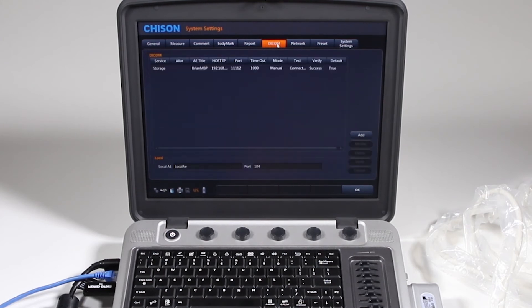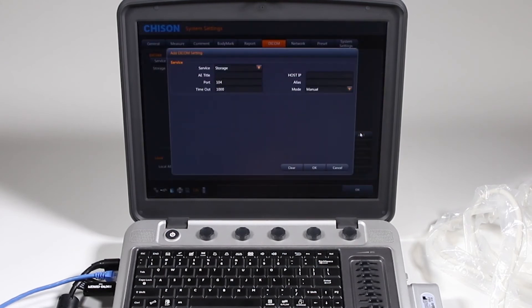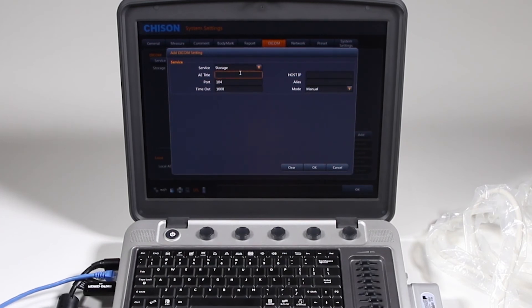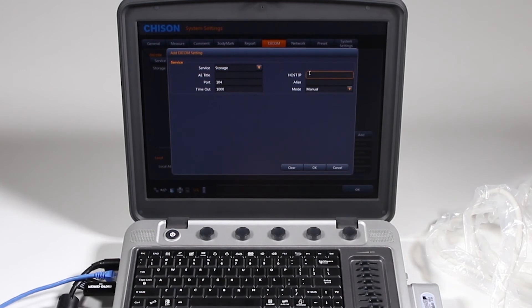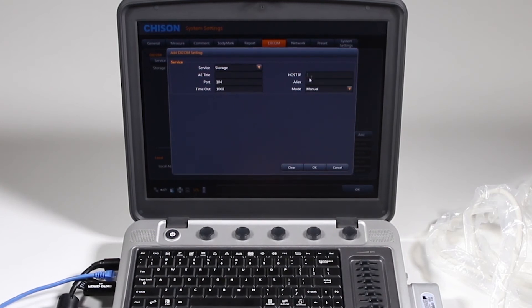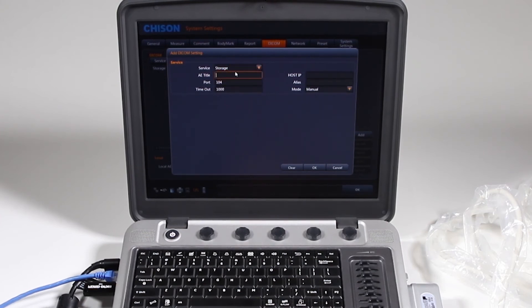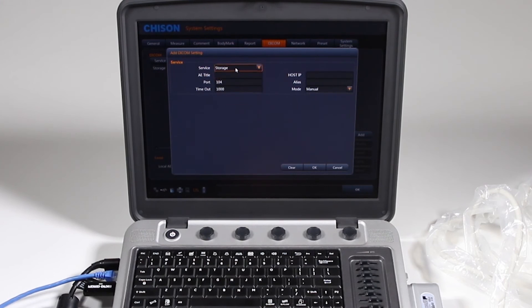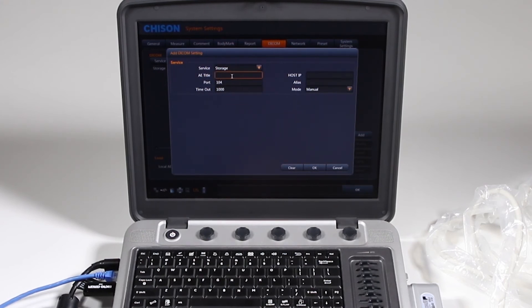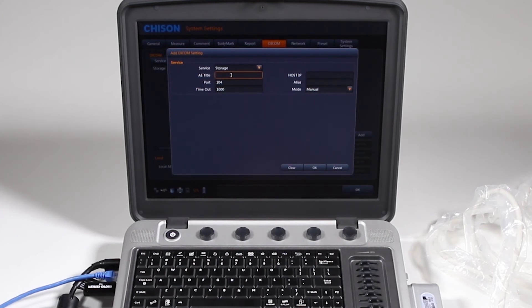So for DICOM, there's some information you have to have in order to get a DICOM storage setup. This is called an AE title, your port number, IP address, and they may or may not give you an alias name to put it under. So you're going to select your service, and that could be storage, print, work list, or structured reports, and the AE title they will give you has to be typed in exactly as they give it to you.